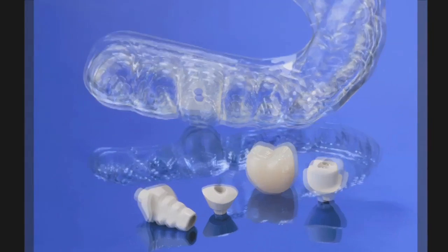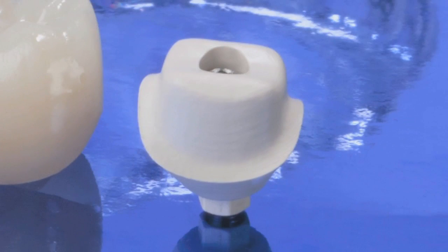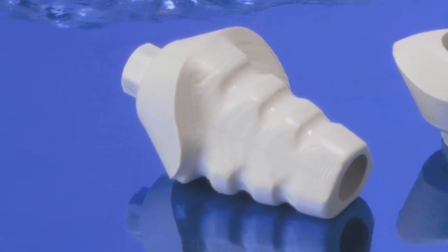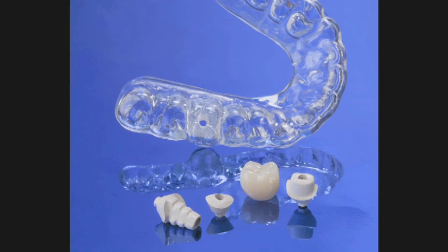This is completed with custom-milled healing abutments, maximizing ultimate tissue contours, custom-milled transitional or temporary abutments used to support the transitional prosthetic appliance or temporary bridge or crown, and custom-milled impression copings which mimic the tissue contours created by the healing abutment or transitional abutment. This technique allows the tissue to heal properly in the best possible position.